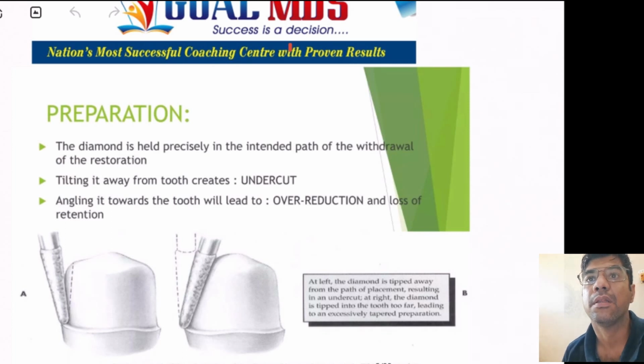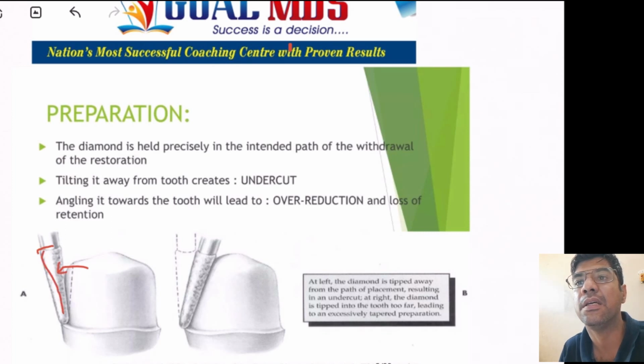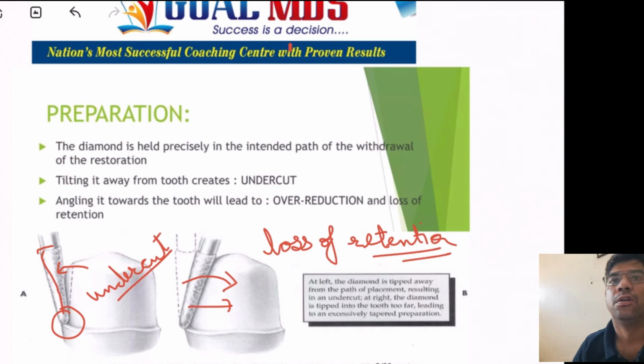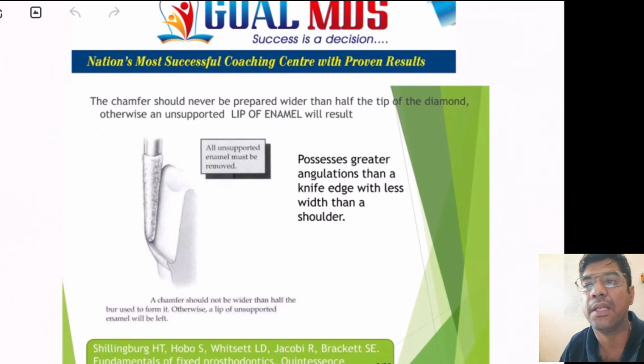So remember, the diamond bur is held precisely in the intended path of withdrawal of the restoration. If it is tilted away from the tooth, that can create an undercut, and angling it toward the tooth will lead to over reduction and loss of retention. So tilting it away from the tooth will create an undercut, whereas angling it toward the tooth will lead to over reduction and the loss of retention.